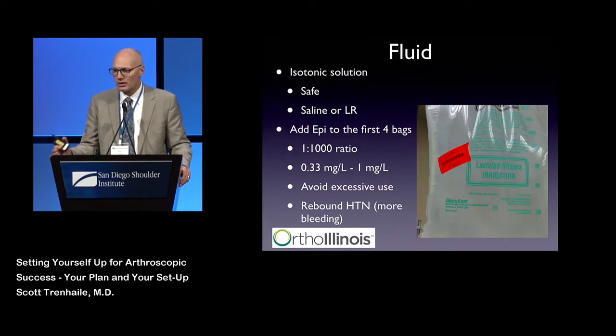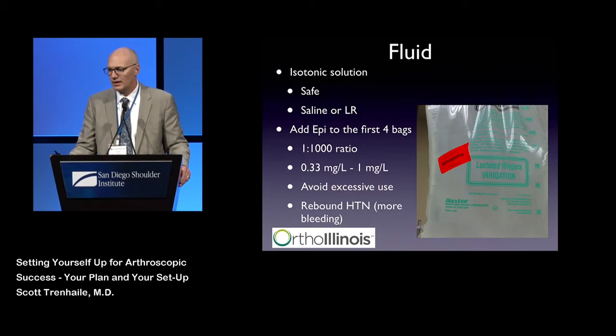And that leads us to the water or the fluid. It's typically an isotonic solution, which is safe, and it's typically saline or lactated Ringer's. I do add epinephrine to the first 4 bags, and you can go up as high as 1 milligram per liter in terms of the bag concentration.